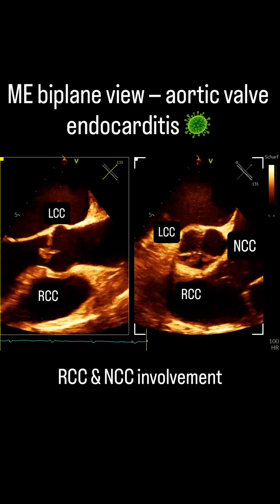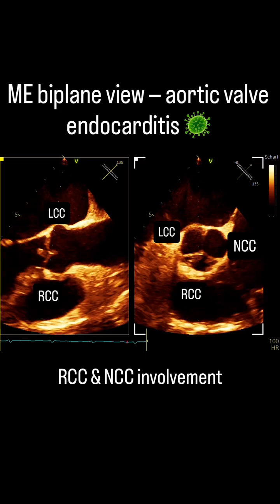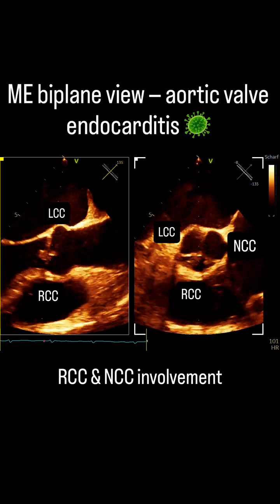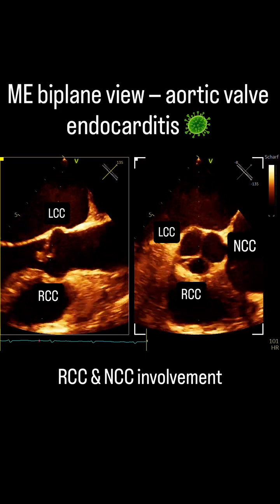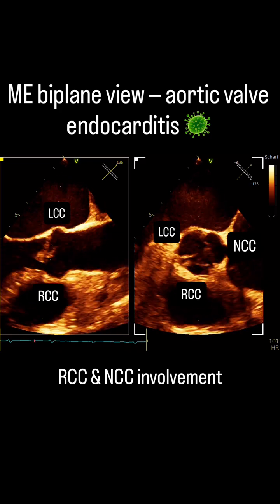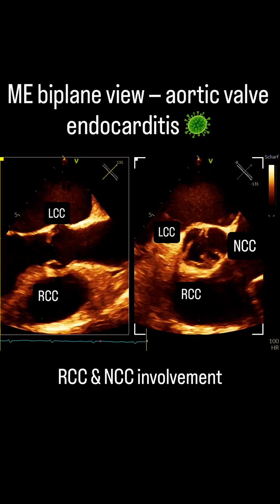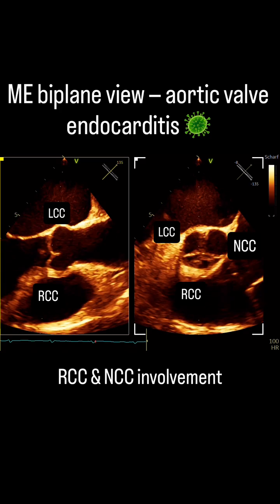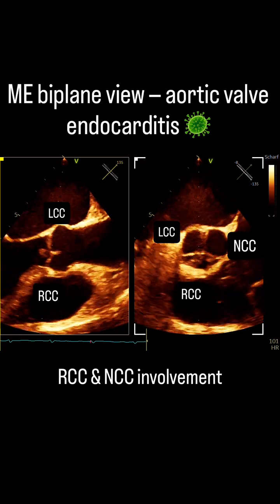So overall, to repeat: be aware of your anatomy, that you identify the proper cusps for the aortic valve, and that you can figure out which cusps are involved in a pathological process. In this case, the NCC and the RCC.